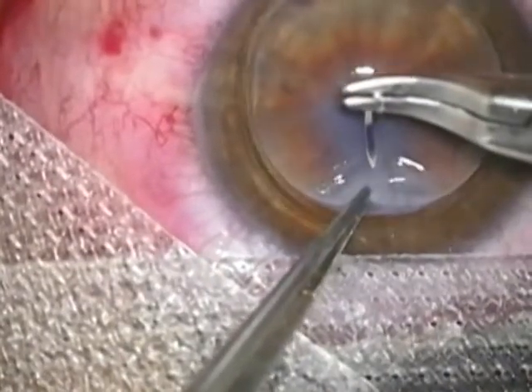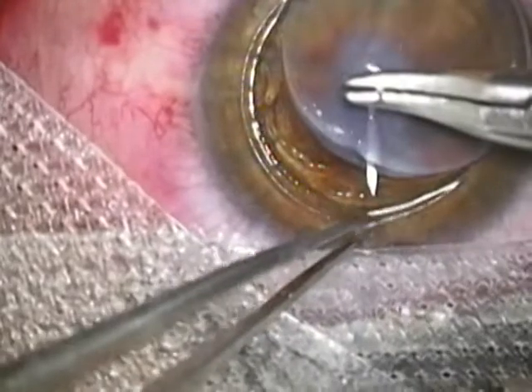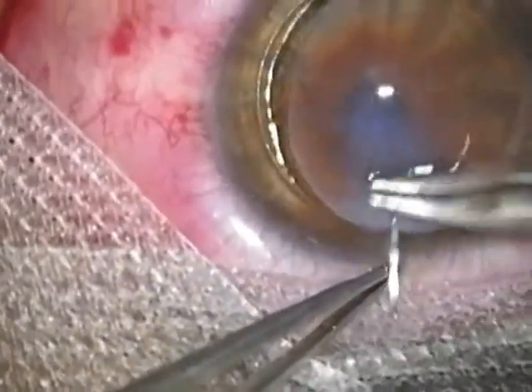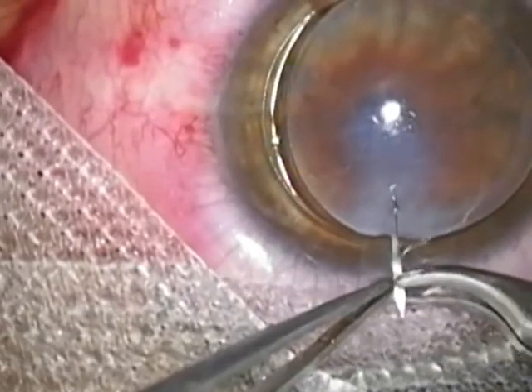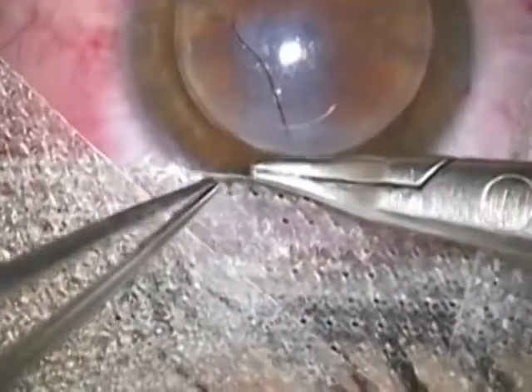To complete the surgery, after removing the endothelium of the donor tissue, we perform the suture in the recipient eye with a technique usually used in lamellar grafts, with nylon 9.0 combined with 10, with separate stitches, or separate stitches combined with a continuous suture.